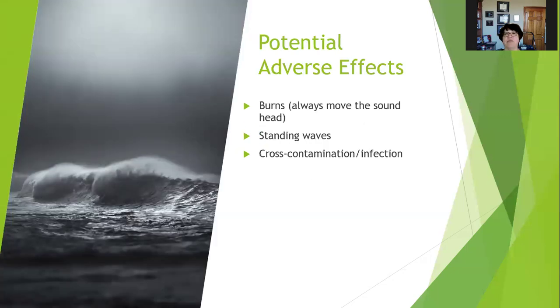So a potential adverse effect is you could burn somebody with ultrasound if you don't move the sound head. So the sound head should always be moving while it's touching the patient. Standing waves, and we'll talk about the standing wave in a second, and cross-contamination or infection.